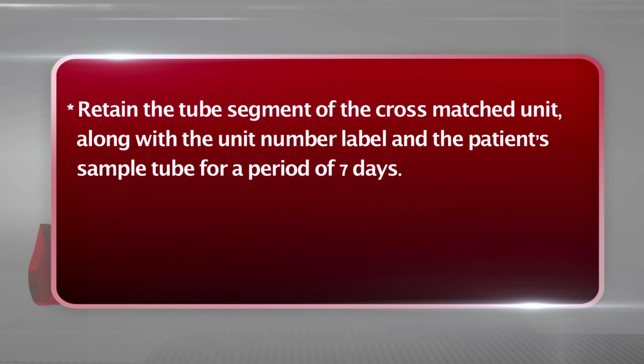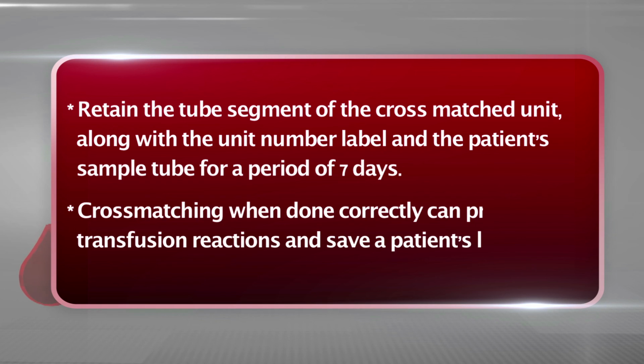Retain the tube segment of the cross-matched unit along with the unit number label and attach to patient's sample vial with an adhesive tape for a period of 7 days. Cross-matching, when done correctly, can prevent transfusion reactions and save a patient's life.